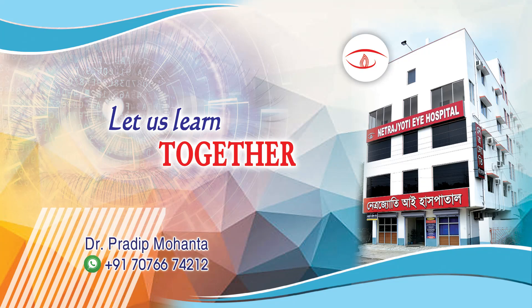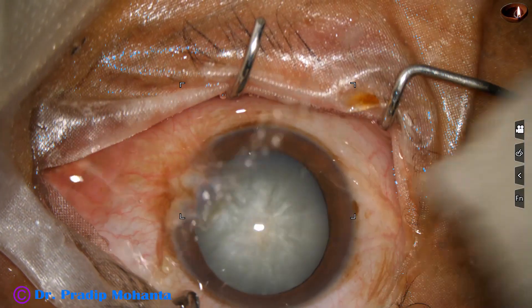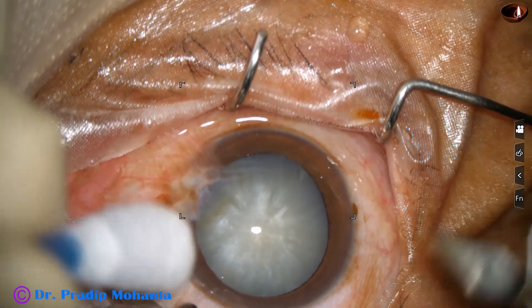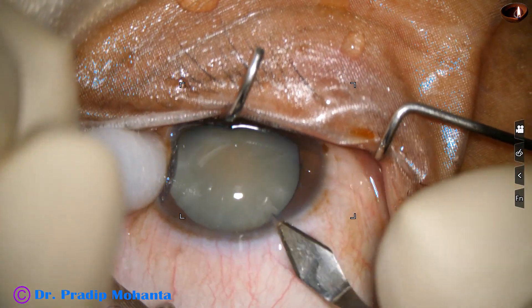Friends, welcome to my workplace at Ranaghat, West Bengal, India. This is an intumescent cataract with pterygium, and in this case we are going to do combined pterygium surgery and phacoemulsification for this intumescent cataract.